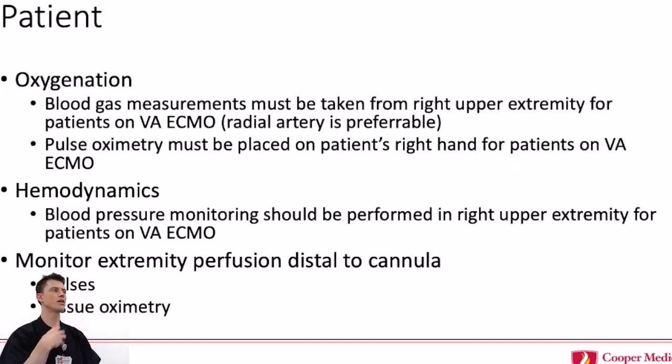So the best place to take the blood gas would be our right radial artery, because that's our furthest vessel from the ECMO circuit. It tells us where everything is mixing and what oxygenation the patient's brain and heart are actually seeing. And the most accurate is from the right radial artery. We'll have some slides to demonstrate that if you're having trouble visualizing it in your brain.